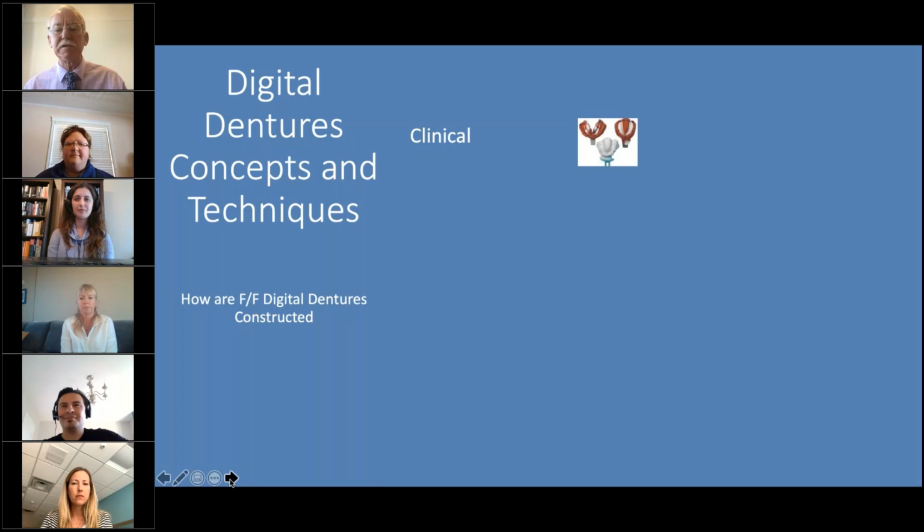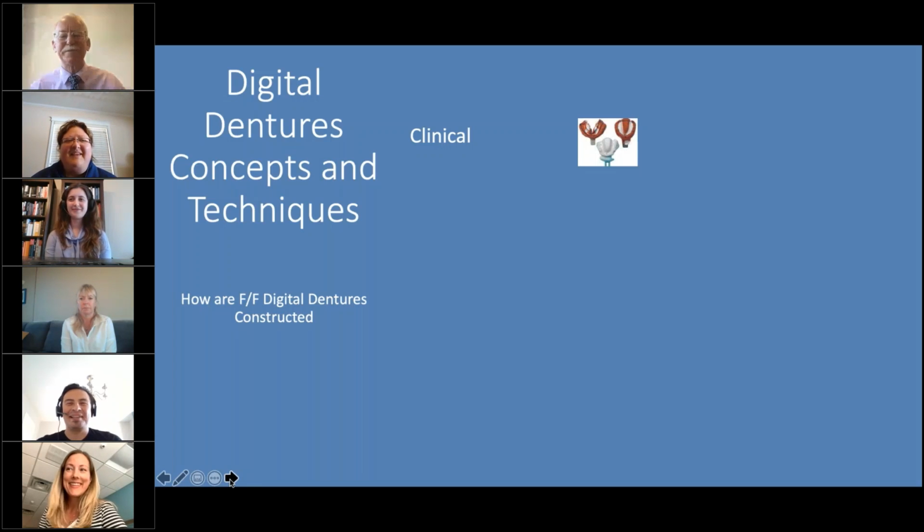You've got to take some impressions, and you notice that vertical dimension and bite are the 2 big ones. And I think, Tanya, you might be using an orange stick with a bit of alginate on it. Is that right? Or no, that's actually Carson. Oh, Carson. That's my associate person. Yeah. So centric tray.